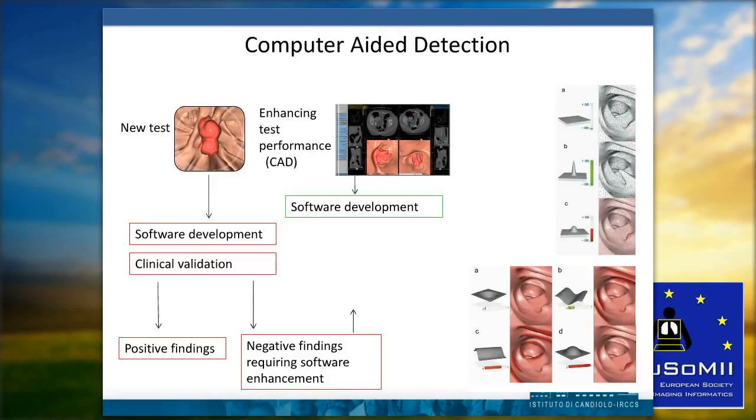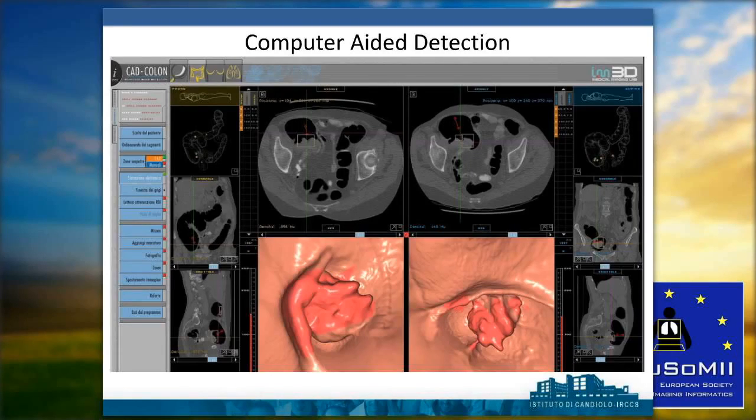And the other point is that we try to identify within the colon lumen those parts of the surface where there was a different curvature, a different shape that could represent a polypoid lesion. So here it is, and all suspicious areas of the surface of the colon were given a different color, or they would put a box around it. Okay, so this is how we developed our CAD system, and we, of course, implemented this CAD system on the pre-existing interface, and here we have it.